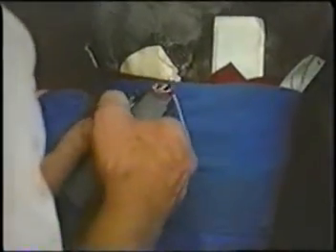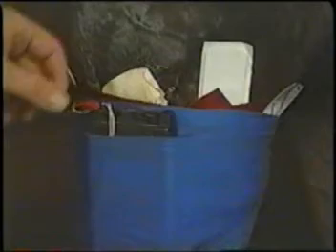The current itself is very insignificant. It's a very weak current. It does not take much to make a horse's muscles contract. The little stimulator has a tiny battery in it which lasts for a long time. You get at least 60 hours out of that tiny battery. It takes a very, very small amount of current to make the muscles of a horse's leg contract.